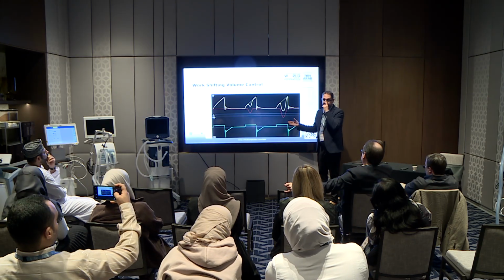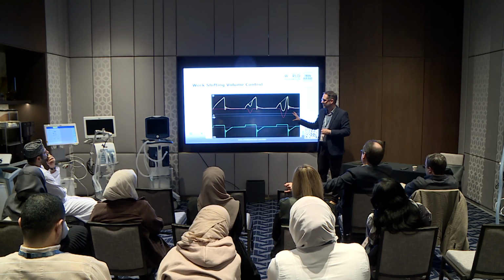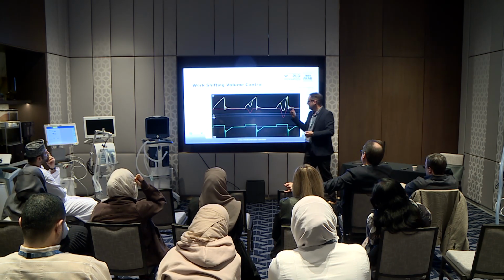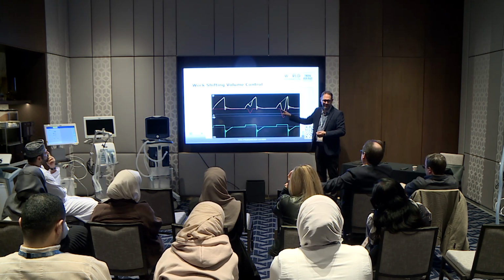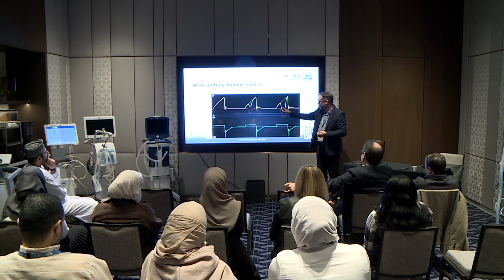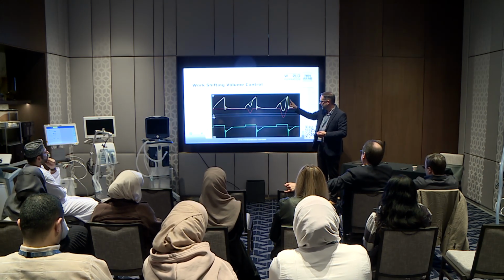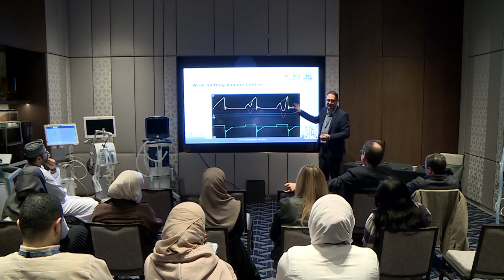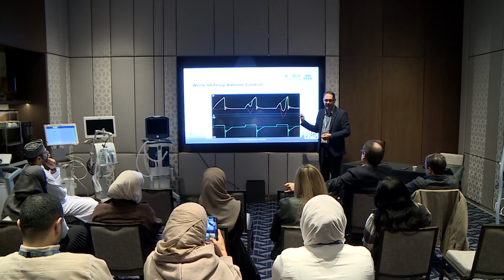And in this example, this is what I would call severe work shifting or under assistance. You could argue that this is not necessarily under assisting. This is under assistance. Again, it's reverse triggering, which I don't know why they did that for this paper, and they should have had them triggering here, but notice that the pressure drops below PEEP. This is PEEP, and it drops below PEEP. This is flow starvation, okay? If you ever see this using volume control, please change your ventilator immediately to a pressure-targeted mode of ventilation.